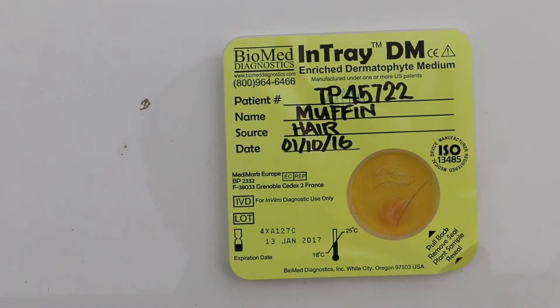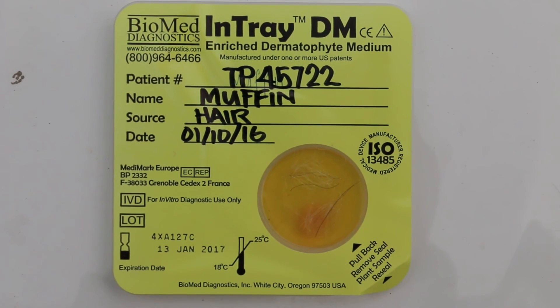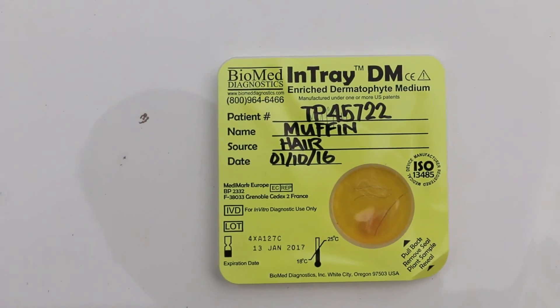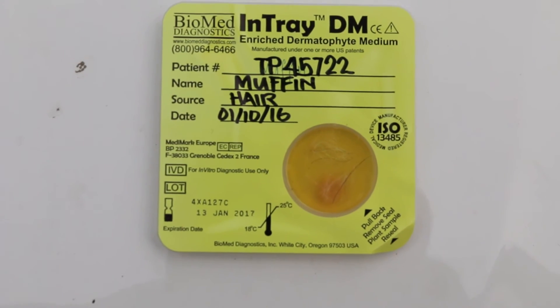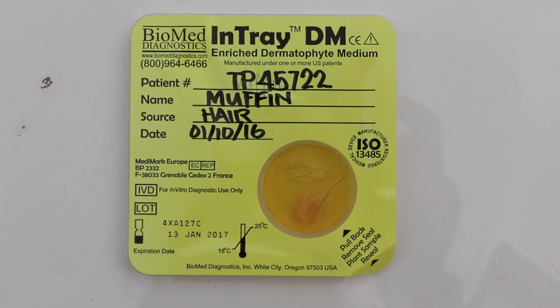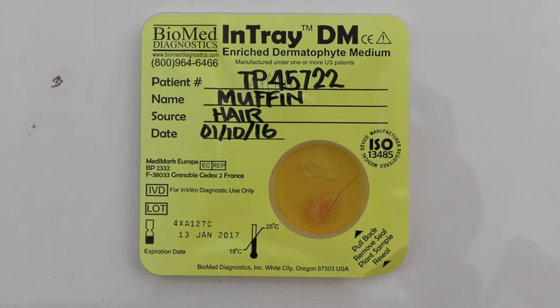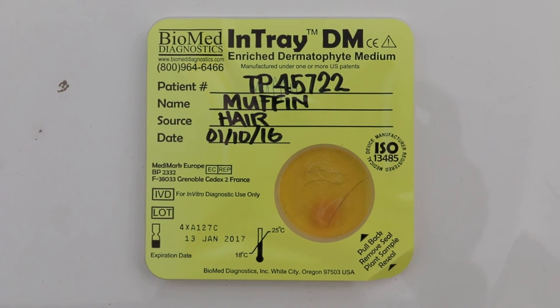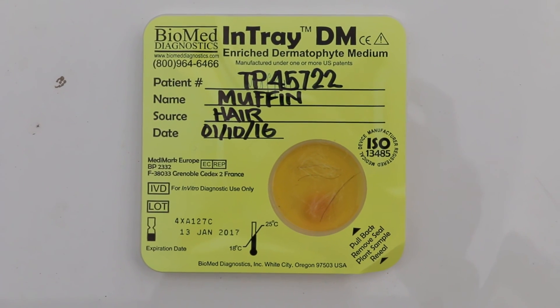You can see the reddish colony in one of the two samples inoculated into the medium — the enriched dermatophyte medium — and this pinkish colony in one of the two samples indicates the growth of dermatophyte. We will review again after another two more days of incubation. This is a ringworm case in a dog as shown in the previous video. Thank you.